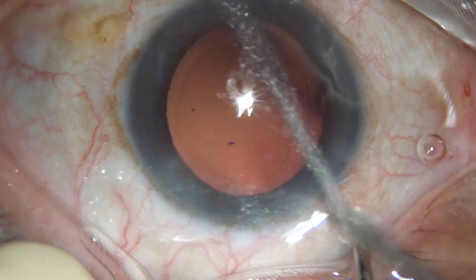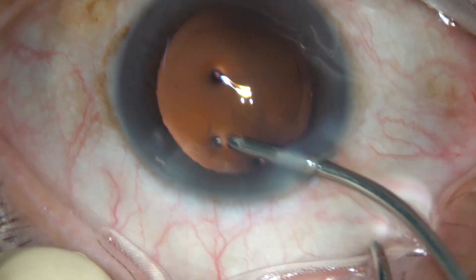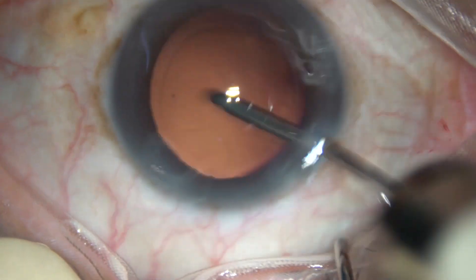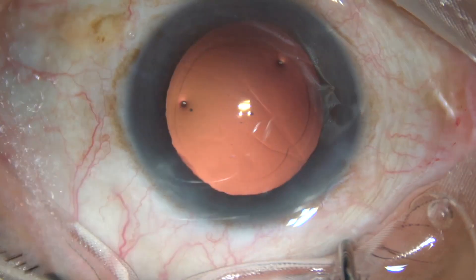Now this is what I call hydro polish — polishing the posterior capsule with a fluid jet — because there are some cells sticking to the posterior capsule. It is being cleaned.